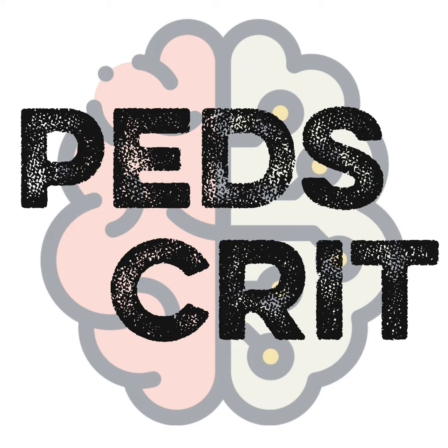So the inflow pressures are the pressures to the pump. And those are really telling you about your preload. So they're telling you if the circuit has enough volume in it to maintain what it's doing. If that number gets too negative, that means that the circuit is sucking blood away from the patient. And if that number gets really positive, that means that you're filled up enough.